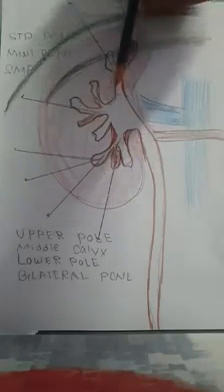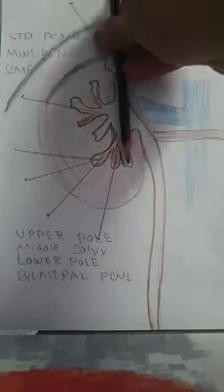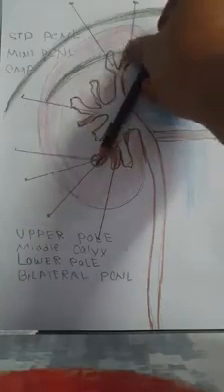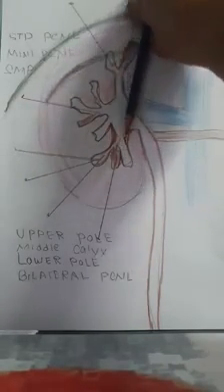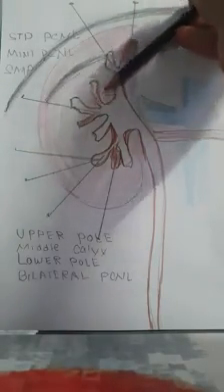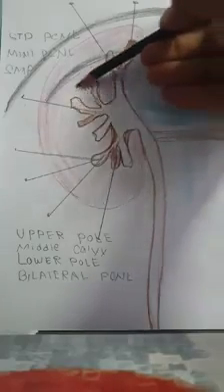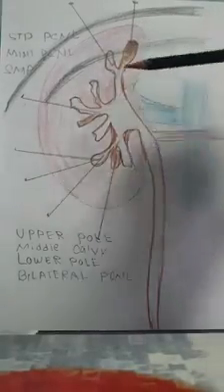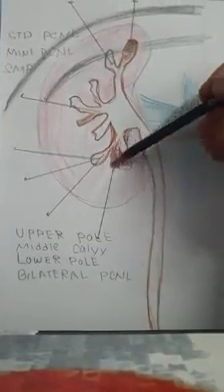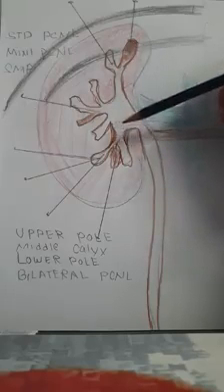And after doing this, it's so easy. We can really reach up to the proximal third here, up to the lower calyceal stones easily. I can go to each of the different calyces here, even the inferior pole. I can also go up to the middle calyx, sometimes up here, but I cannot go here. This is the only problem if you are approaching from this one, and sometimes this can also be problematic if you are dealing with an upper pole approach. This is because there is too much torque here, I cannot reach here, but up to the middle pole and up to the inferior pole, I can so nicely remove all the stones. This is a very fantastic way of doing PCNLs.